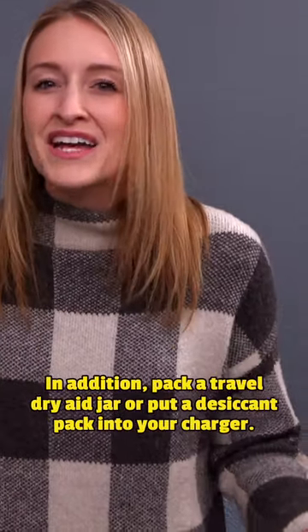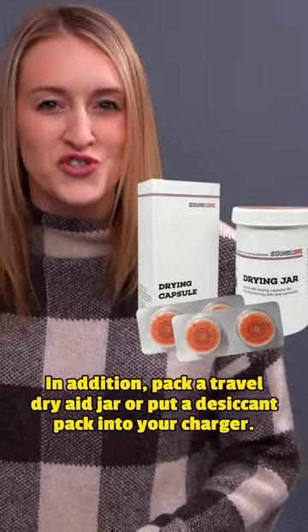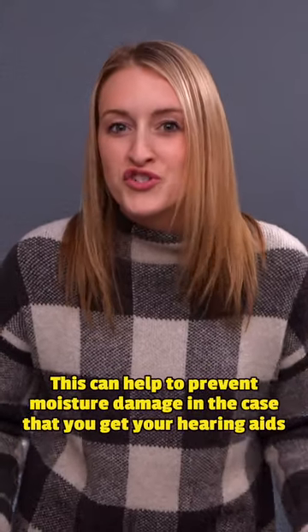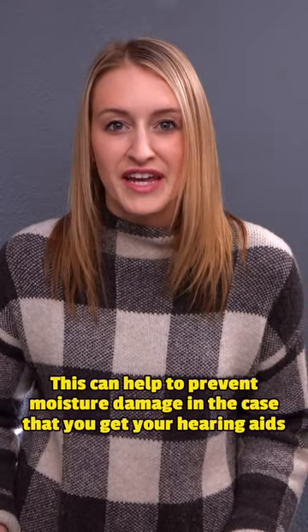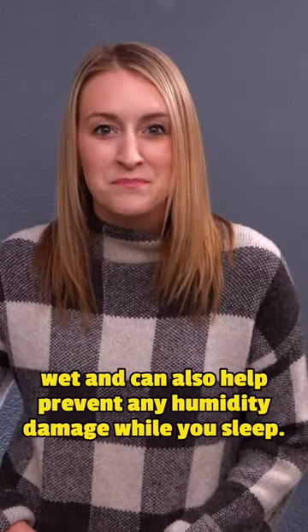In addition, pack a travel dry aid jar or put a desiccant pack into your charger. This can help to prevent moisture damage in the case that you get your hearing aids wet, and can also help prevent any humidity damage while you sleep.